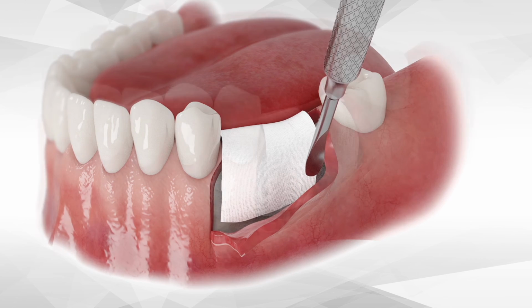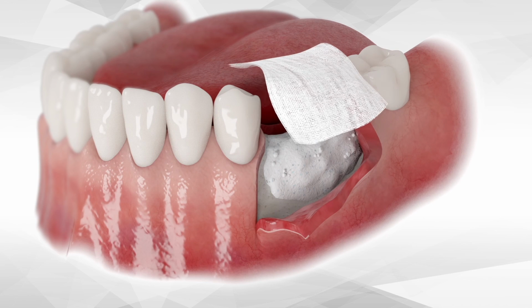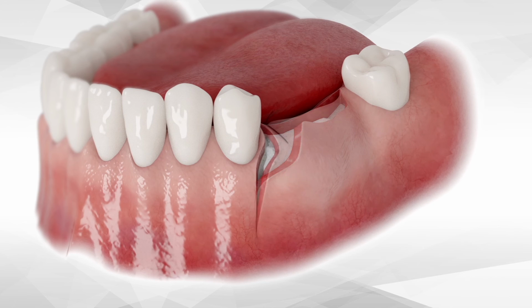Once compaction of the graft is done, remove the gauze and proceed with soft tissue closure by stretching the mesial corner and securing it with a suture. Then the distal corner is secured, then the middle part, followed by additional sutures as is needed, and finally the vertical incision should be sutured.